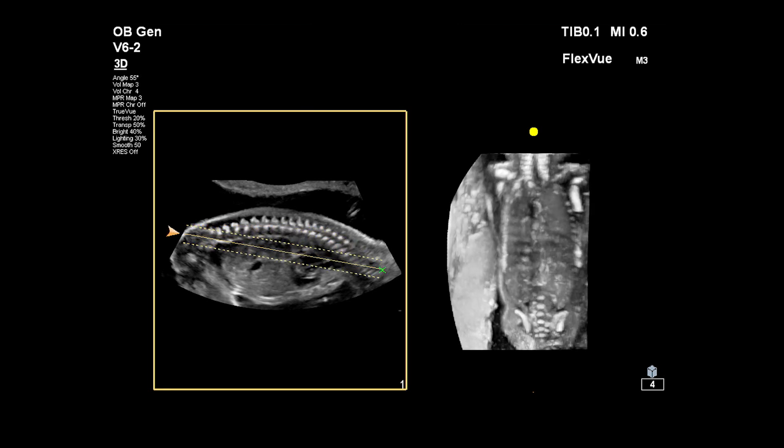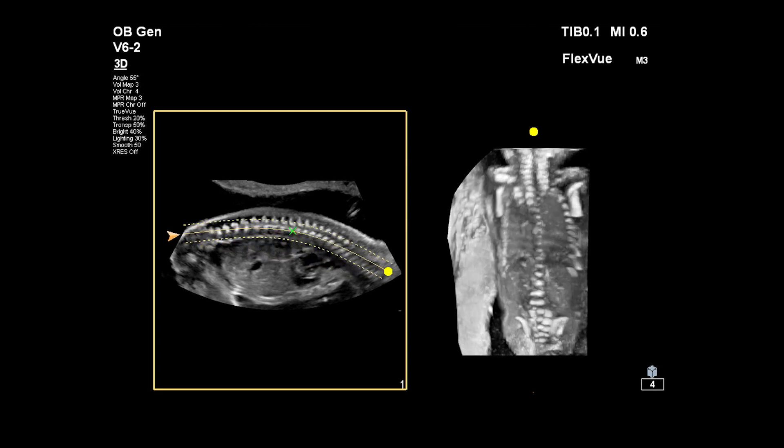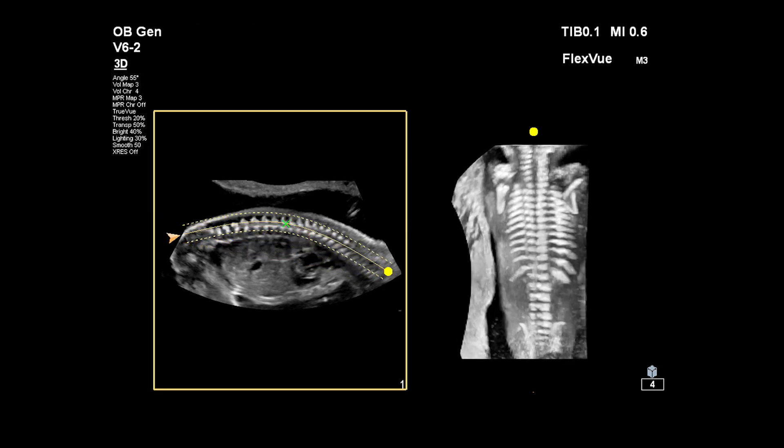I'm going to place this right at the cervical spine, and then, since we're using Curve Trace, place this other point right in the middle of the spinal column.